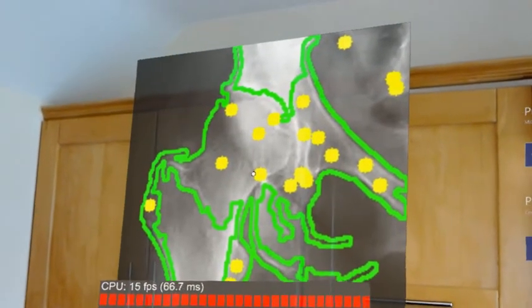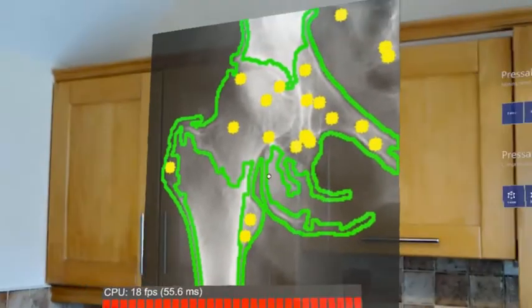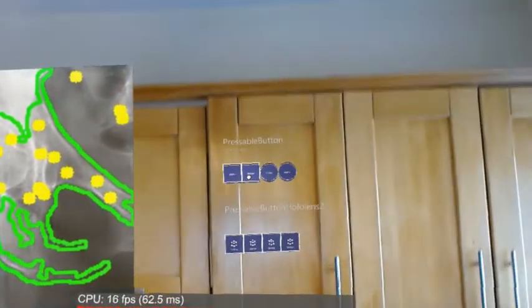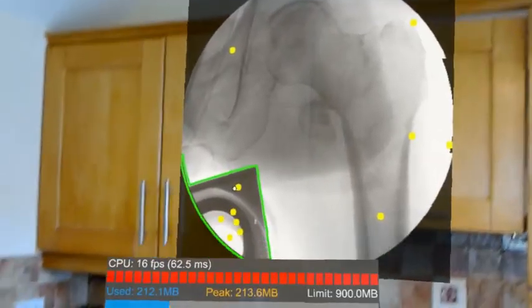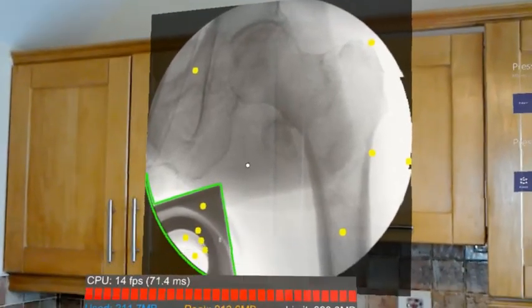Yeah, so essentially it's calling our server, it's launching a Python script that will run OpenCV on the hip itself, and then do edge detection. And I think we have a fourth one. Yeah, and this is one with the bar from the X-ray above.